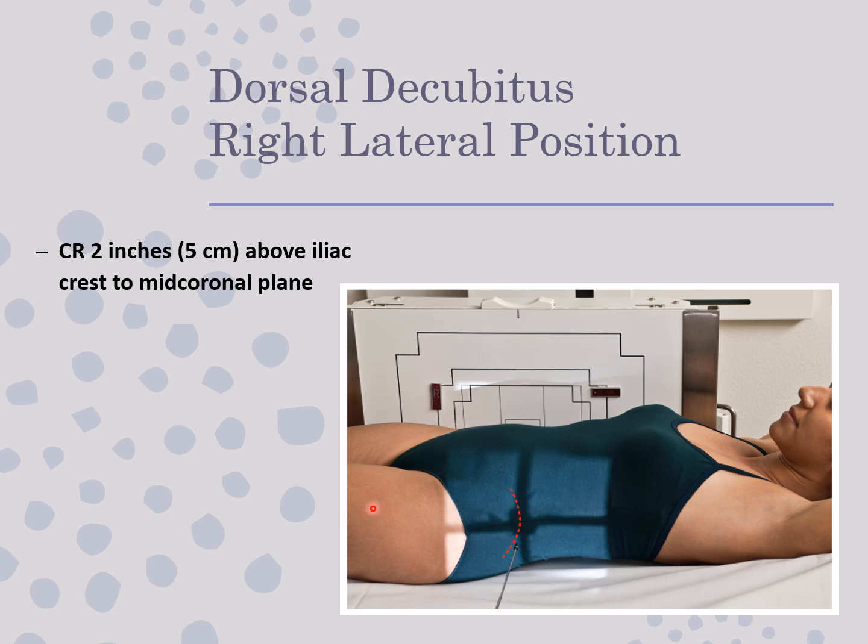40-inch SID, a 14 by 17. However you would do the patient, she probably fits one IR placed portrait to her, which would look landscape to us. If your patient was bigger than that, you potentially would have to do 2 image receptors placed landscape to the patient, which would look portrait to us.